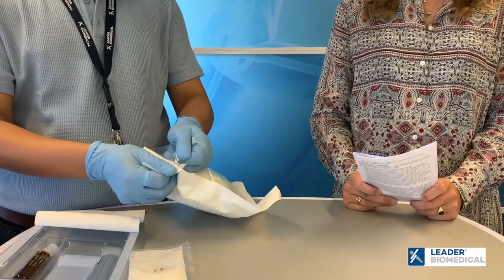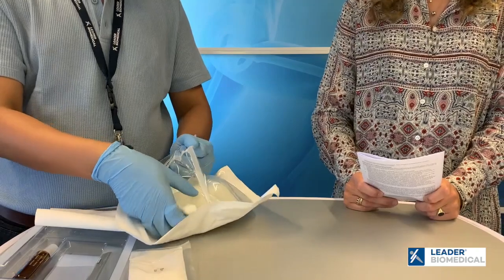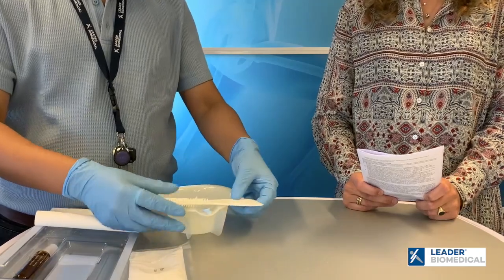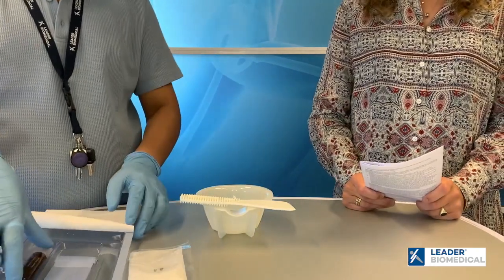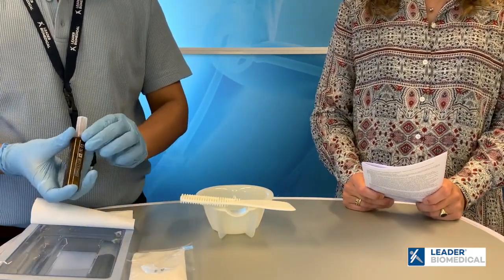Next we will open our mixing system — the bowl and the spatula. A cement can be mixed in an open or closed system. We're doing it with a bowl and spatula manually, but this can also be done with a closed mixing and application system.